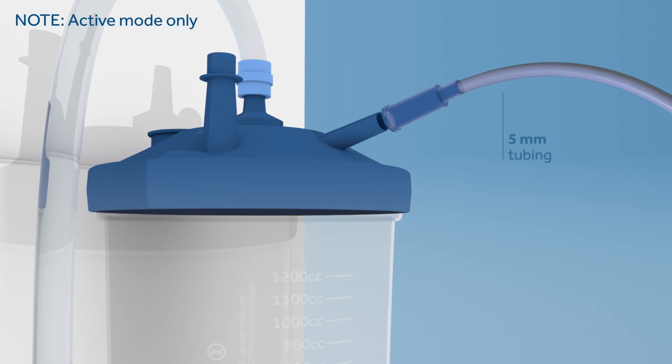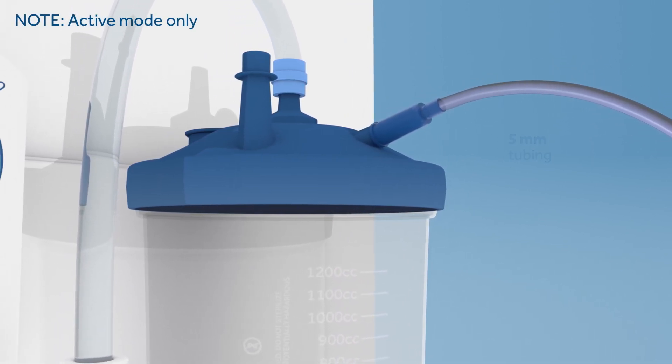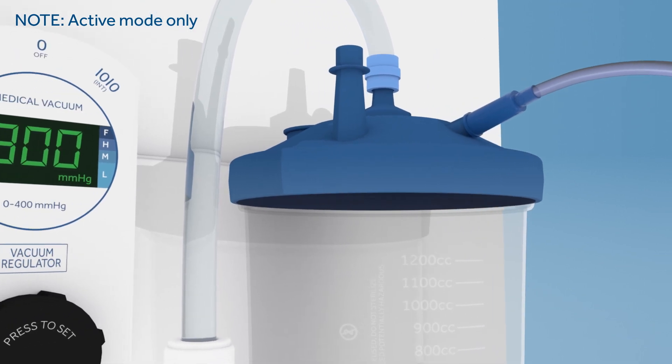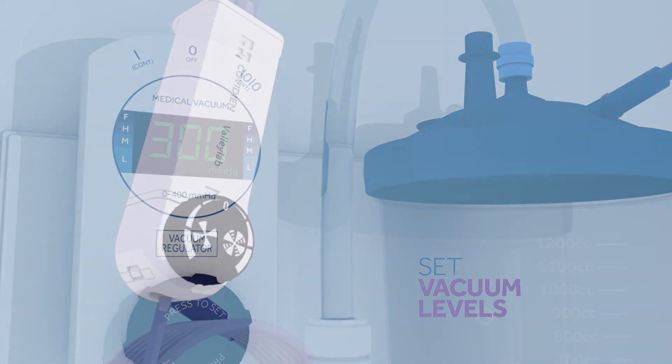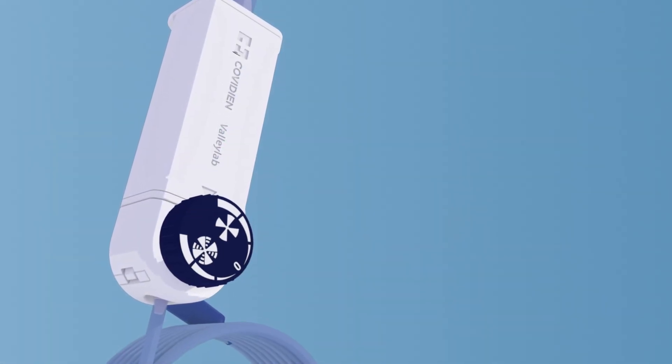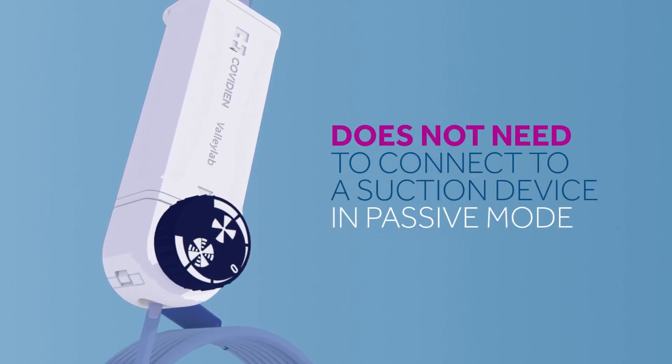Connect the long, thin tubing to a free port on the wall suction canister or compatible suction unit outside the sterile field. Set the suction regulator between 100 and 400 millimeters of mercury. To set the laparoscopic smoke evacuation system in passive mode, the back end of the device does not need to connect to a suction device.